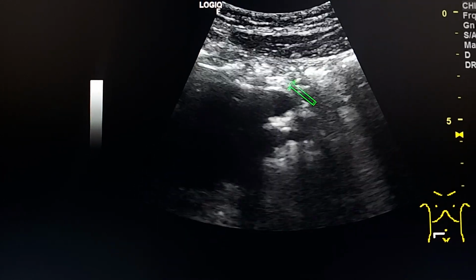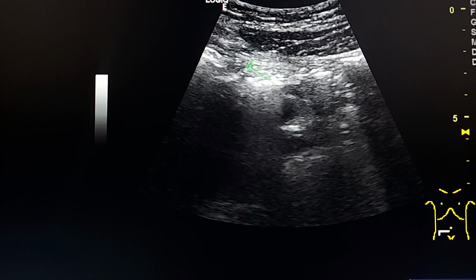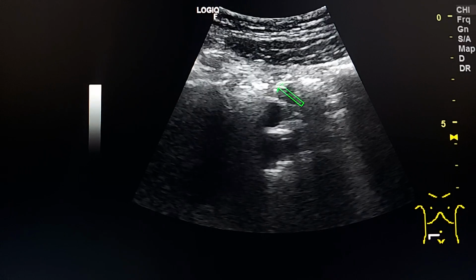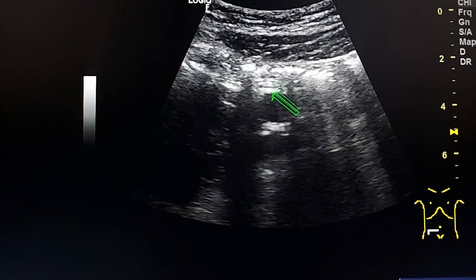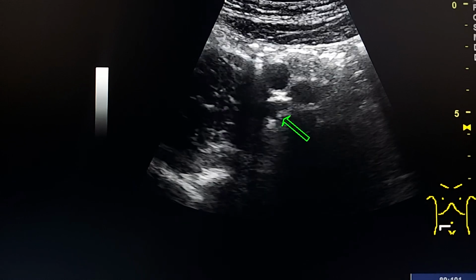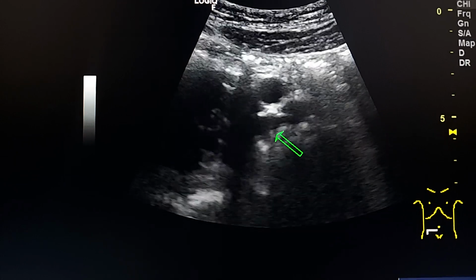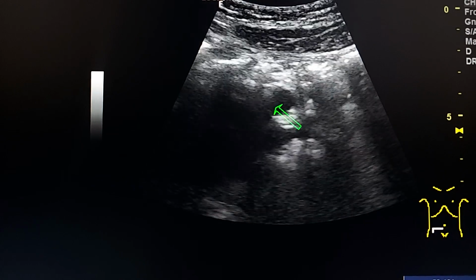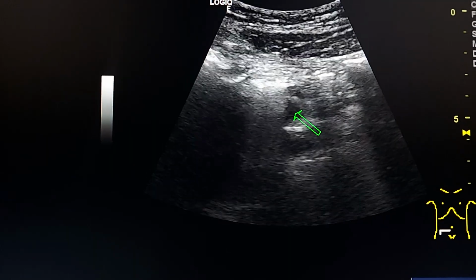First, to see these structures by pushing away the small bowel loops and the gas contents for an acoustic window to these structures, and second, we see that the vein is easily identified from the artery. This is the artery and this is the dilated ureter anterior to them.